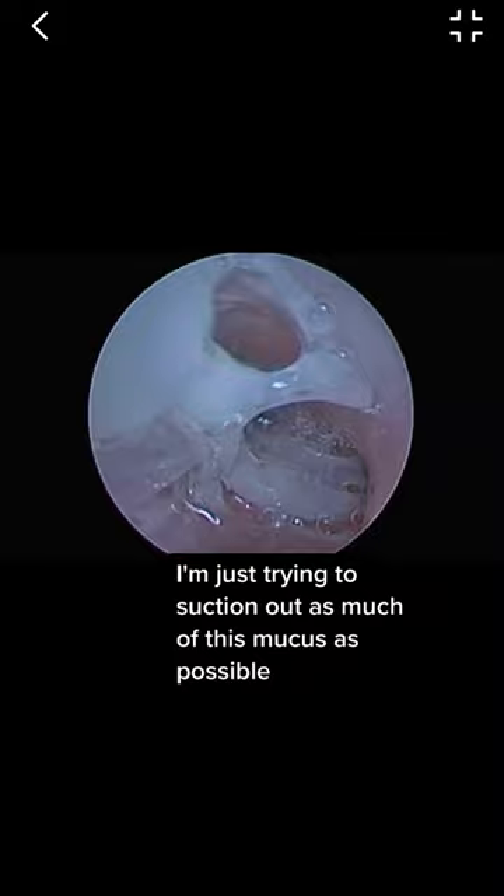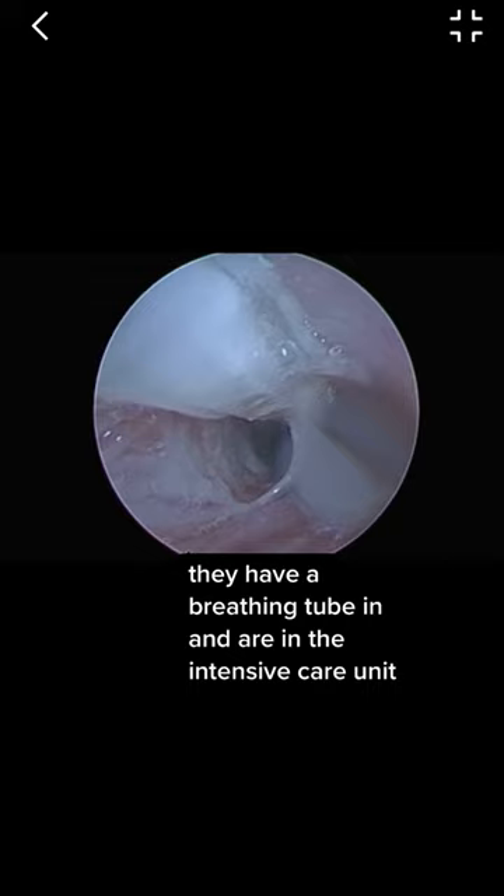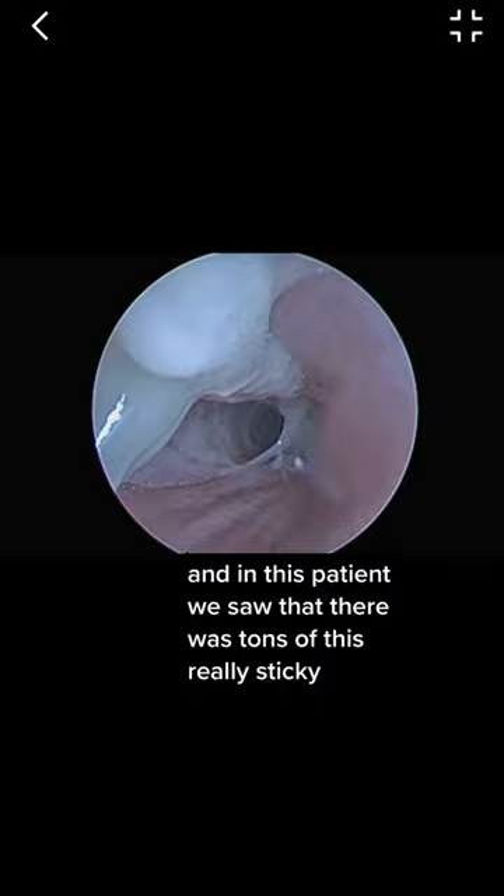This patient is pretty sick. They have a breathing tube in and are in the intensive care unit. The intensive care unit called us to see if we could assess the airway with a direct laryngoscopy and bronchoscopy to see what's going on. In this patient, we saw that there was tons of this really sticky mucus.